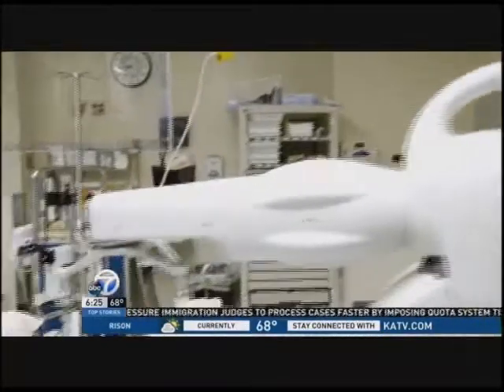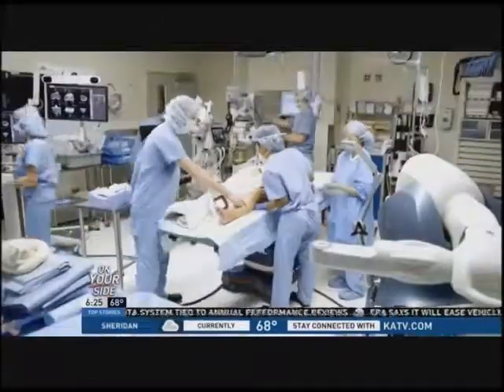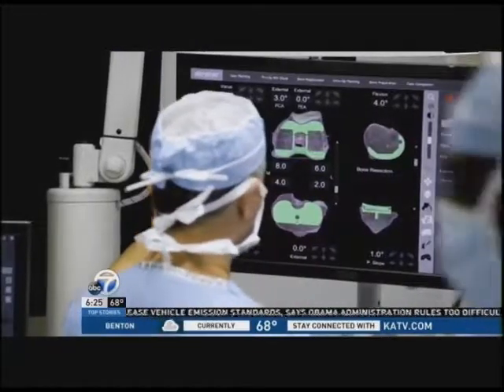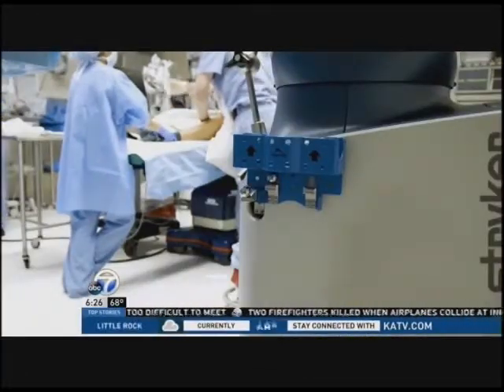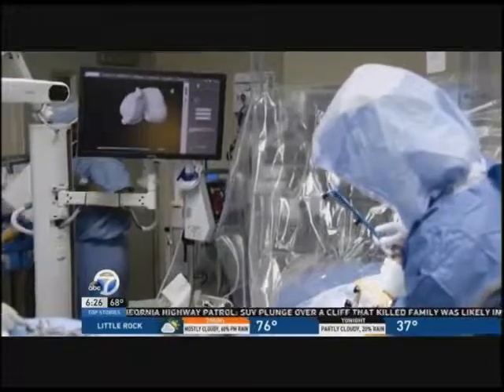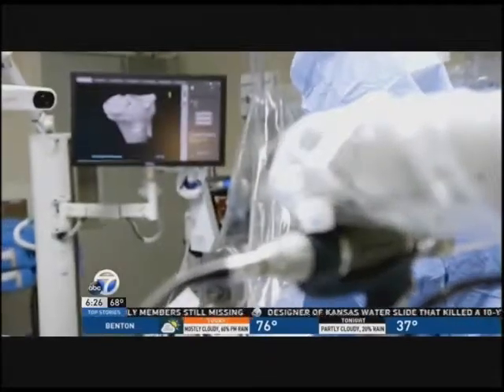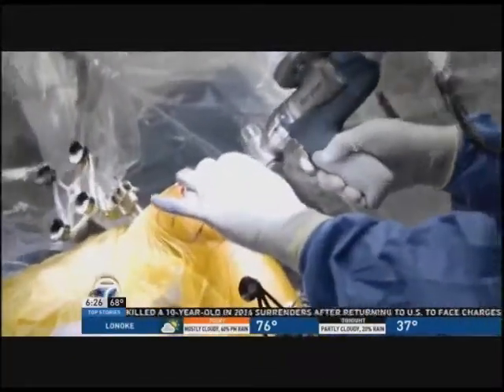Yes, getting video now of the robot and how you guys utilize it. So tell us a little about what this video is showing us and how you guys actually utilize this in a surgical procedure. A lot of what that video is showing happens before we ever get in the operating room. We have very specialized assistants that help register the patients or make sure the robot is working perfectly. We already have the preoperative plan, and once everything is done with the checkpoints, what they're showing right now is that we take a probe and we basically verify where the robot thinks we're placing the probe, so that way we're all on the same page between the robot and the surgeon, and that then allows us to make the cuts where we need to make them based upon where the patient's CT scan determined it and where we feel like in real time we are based upon that patient's anatomy.